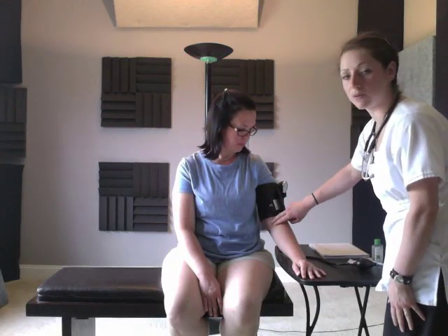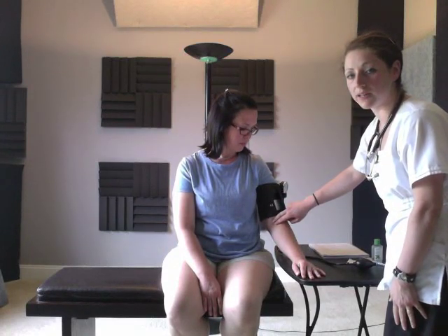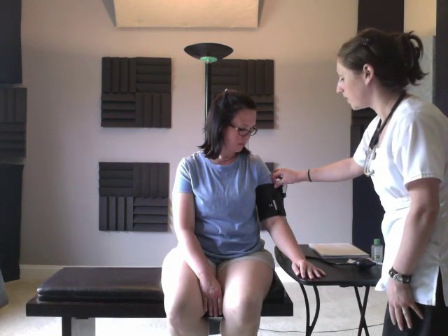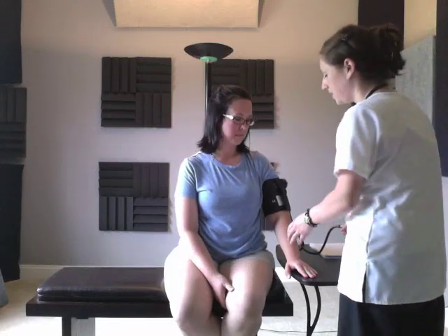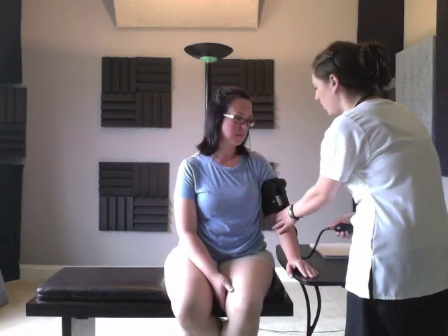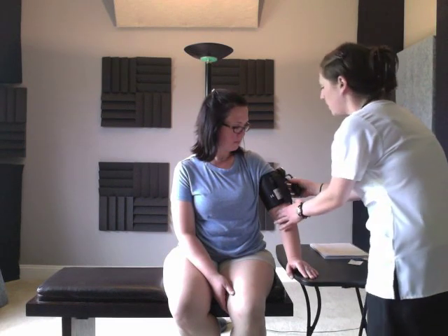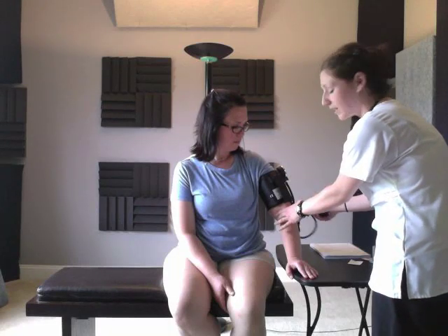Prior to placing the blood pressure cuff, palpate the brachial artery, which is located medial to the biceps muscle. Once you find the location of this artery, place your blood pressure cuff approximately two and a half centimeters above its location. With your blood pressure cuff in place, continue to palpate the brachial pulse. While palpating, start applying pressure to the cuff until you can no longer feel the brachial pulsation. Note the number on the cuff when the absence of this pulsation occurs. At this point, rapidly and completely deflate your cuff.